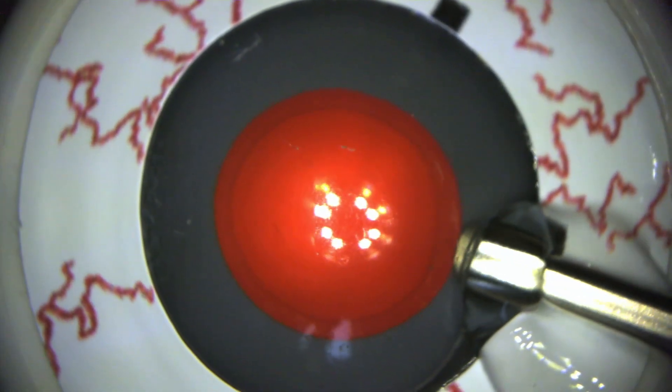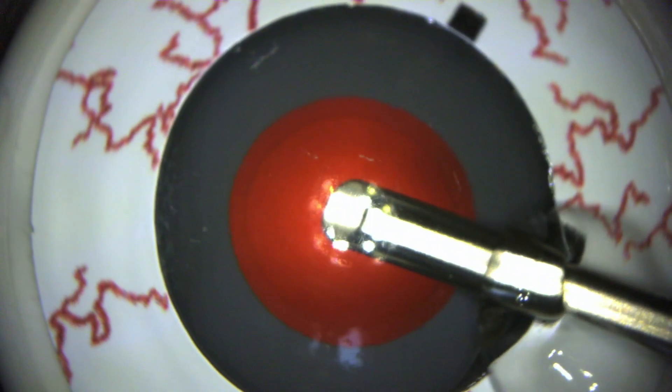Insert the injector through the primary incision. With the tip of the injector just past mid-pupil, slowly advance the device.